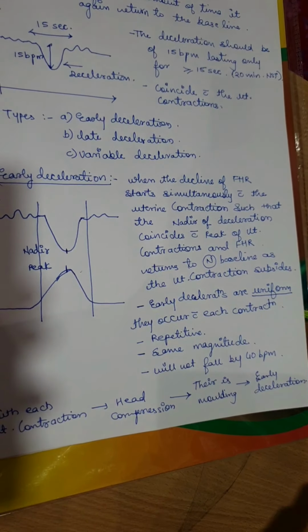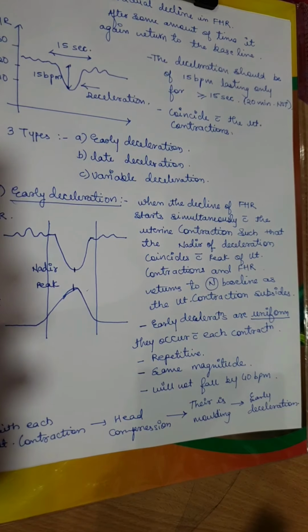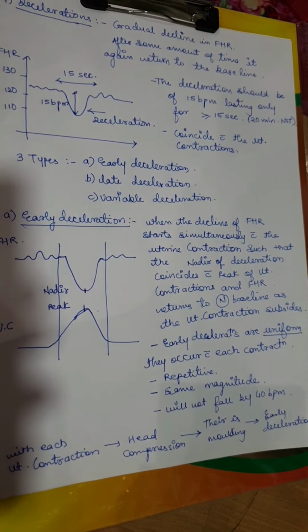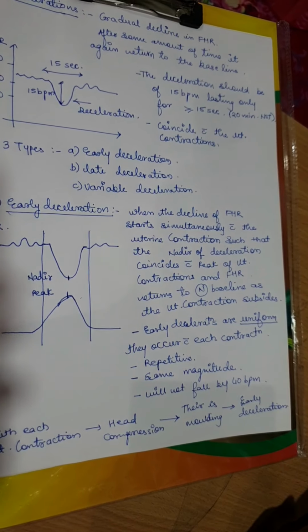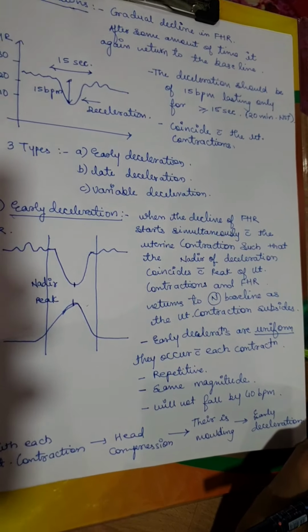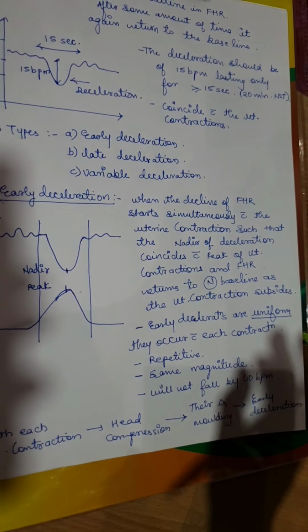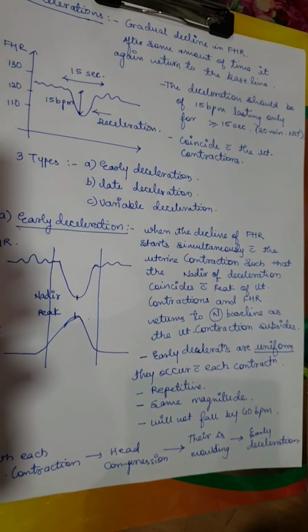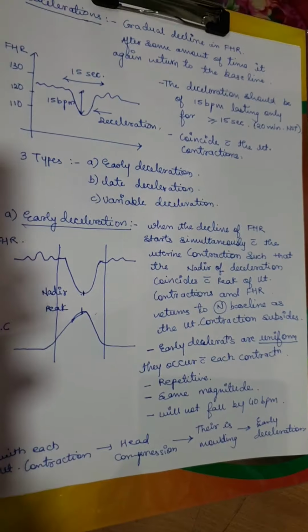You can allow the process of labor to continue as it was going on. There should be no interventional management. So there must be no rush. The early deceleration is the physiological response occurring due to head compression with each uterine contraction.